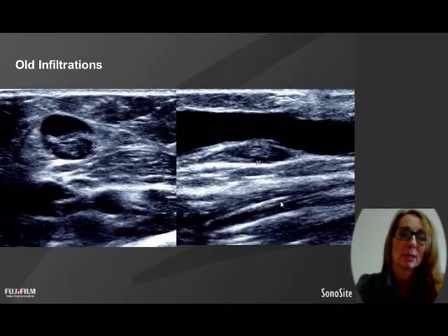Another thing I see a bit of that we don't realise we're doing until we look with ultrasound is that this fistula was a little bit soft, needed really good tourniquet, but it was new, so we were a bit nervous about using too much tourniquet. They've punctured and this is tented down. By the time they've pushed through, they've nicked the back wall.